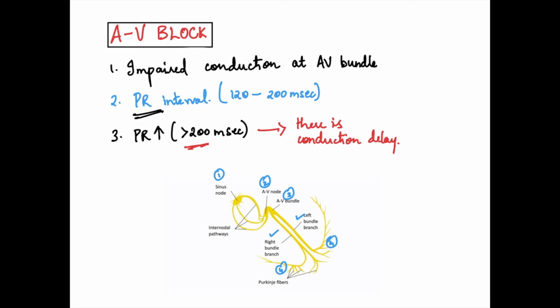And okay, guys, that's all about AV block and its types. I made it very simple for you guys. Do refer to more books, study more about this to gain more knowledge and better understanding about AV block and its ECG. Practice more ECGs so that you'll be able to crack any type of ECG, any type of block. So that's all about AV block.